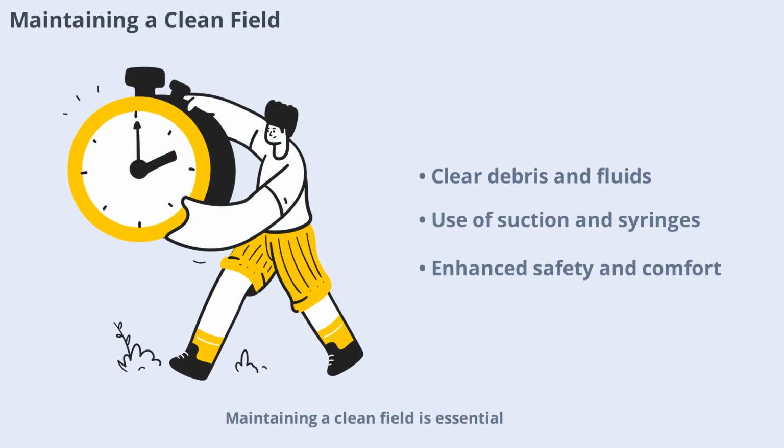Maintaining a clean field is essential for both visibility and infection control. Throughout periodontal procedures, clinicians must regularly clear away debris, saliva, and blood to ensure a clear view and reduce contamination risks. This is achieved using suction devices, air, water syringes, and careful technique. A clean field not only supports accurate instrumentation, but also enhances patient safety and comfort.